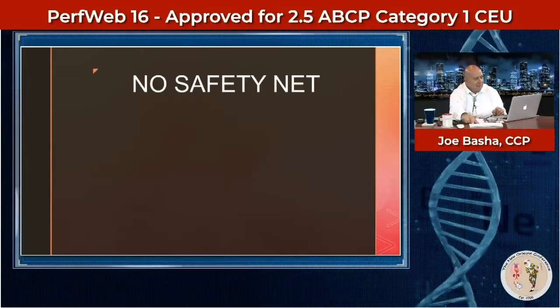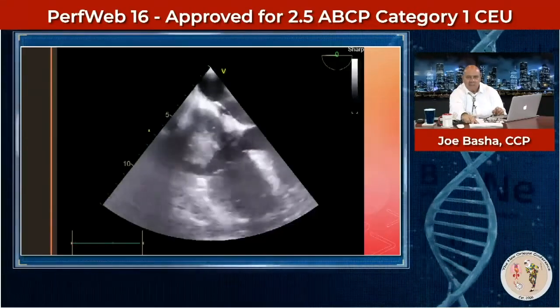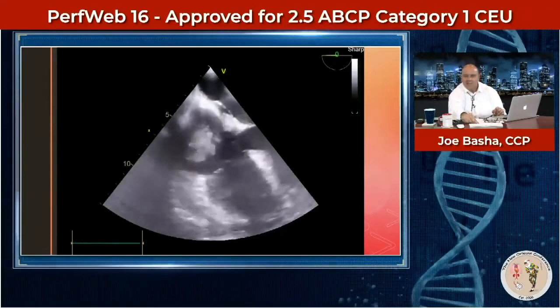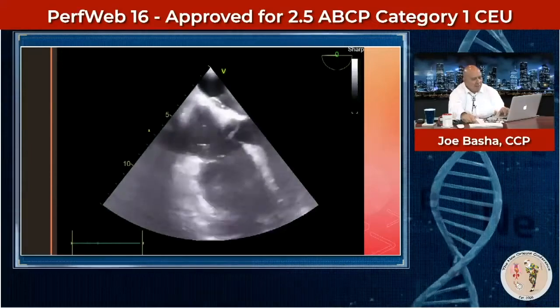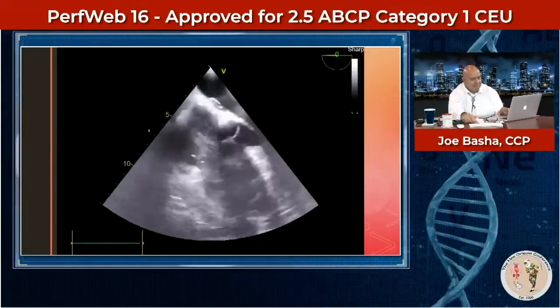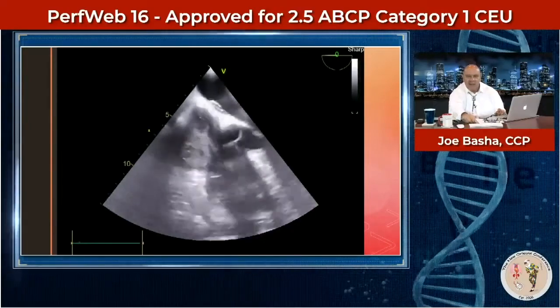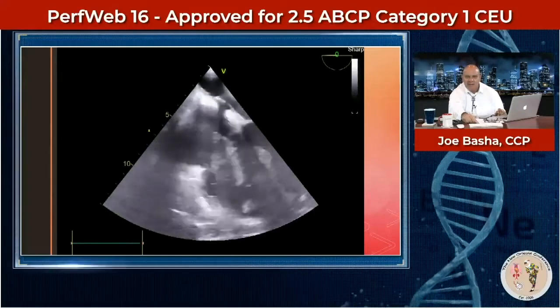Okay, now, take a look at that. Everybody, I want everybody who's watching to take a real good look at that. See that great big mass going back and forth from the right atrium to the right ventricle?